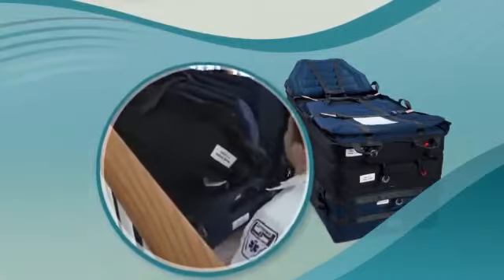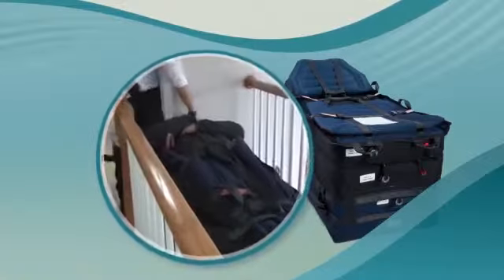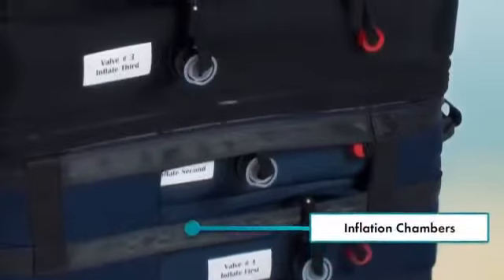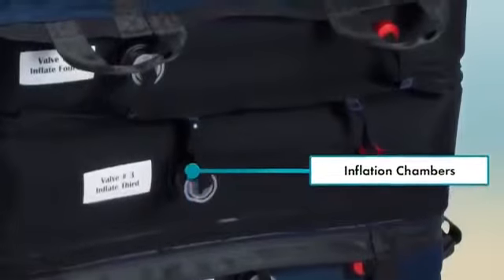A minimum of 3 caregivers is needed to use the Evacuation HoverJack 2. It is a latex-free device. The Evacuation HoverJack 2 has 4 inflation chambers. Each one has a black one-way valve through which the air supply inflates the chamber.